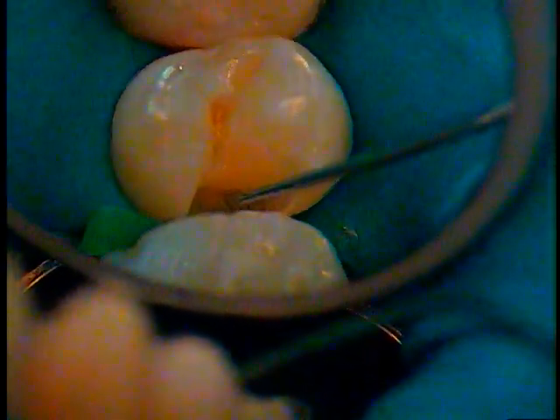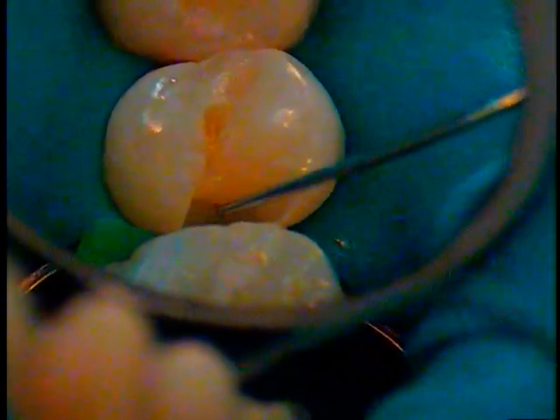I'm going to use my small end of my Explorer, which I have here. I like this end. It has a little hook on the end of it like that, and I can get down in there and get up underneath and put it right in against the axial wall. That's where it's going, nowhere else, just against the axial. And then I'm going to cure that for 20 seconds. That'll shut the door on any pulpal response issues. Not only that, but using a rubber dam.